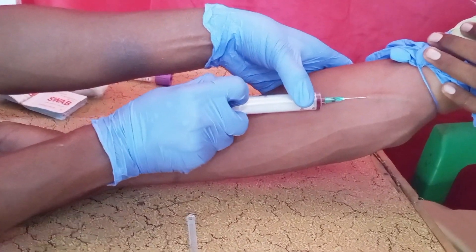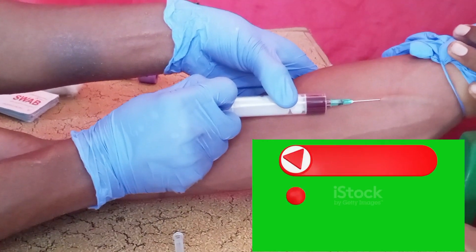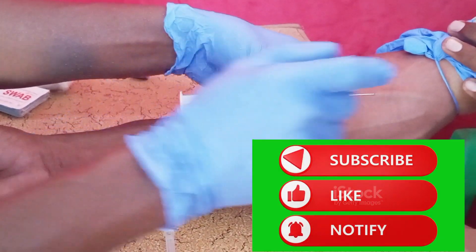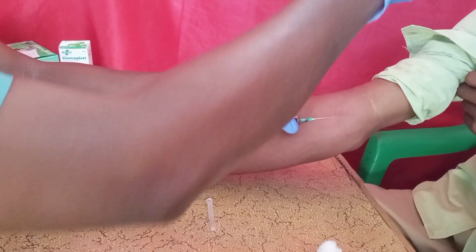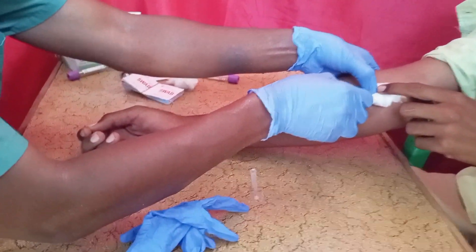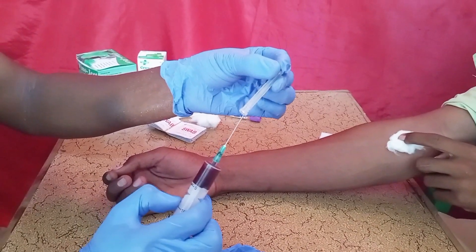You pull back the plunger gently like this to draw the blood. Then, first release the tourniquet. Apply cotton wool on the area where you gave the shot, then remove the needle, then recap the needle.